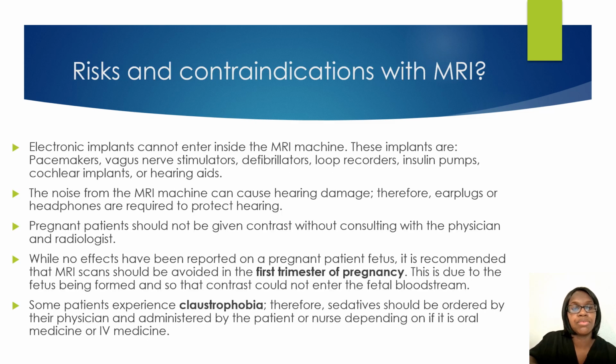Whenever we are talking about risk and contraindications, we're talking about those electronic implants that cannot enter inside of the room unless the patient provides an implant card to determine if it can go inside the room or not. And you also have patients who are pregnant. They can have an MRI scan, but they cannot have it with contrast.